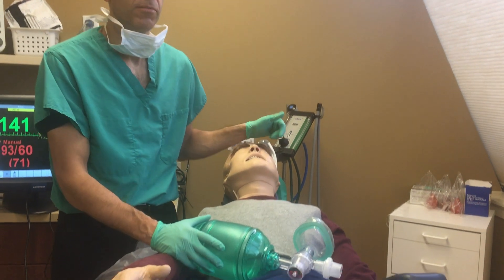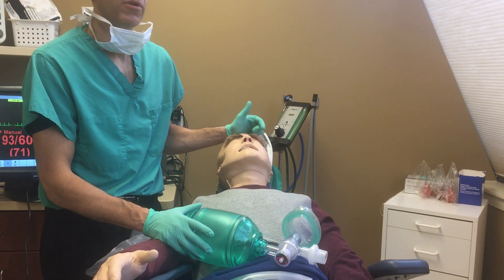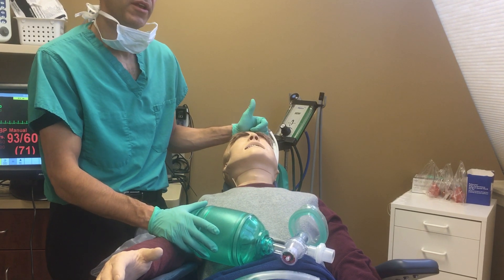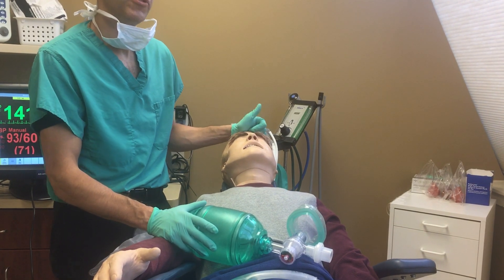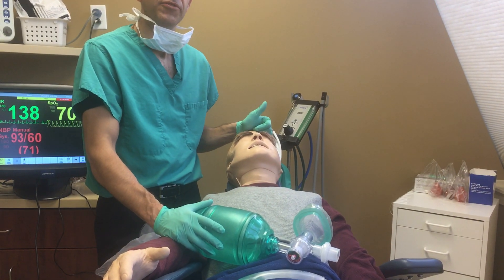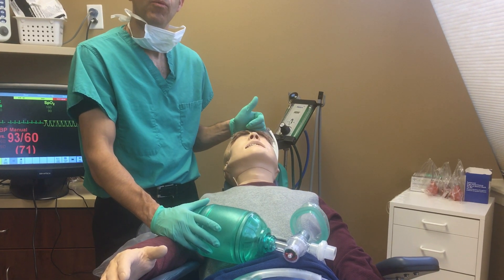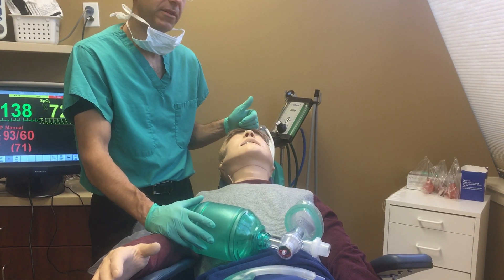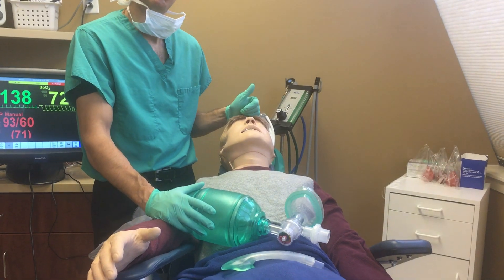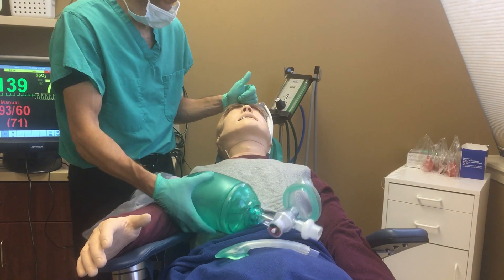Part of being able to manage a medical emergency with a sedated patient that we're unable to ventilate is to practice and to know exactly what emergency airway intervention you're going to use if you're having difficulty. So let's pick up a scenario where we are trying to bag mask ventilate and we're going to have to move forward to a different airway system in order to improve the situation.